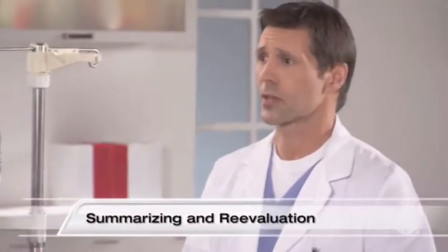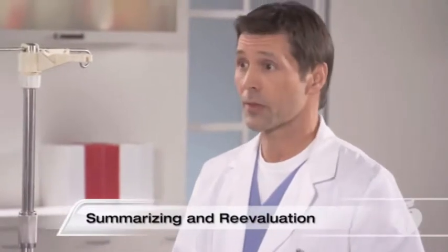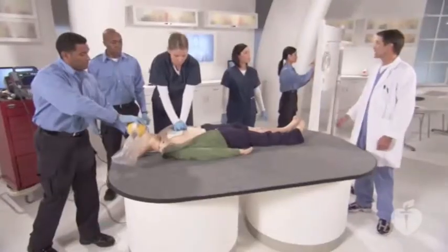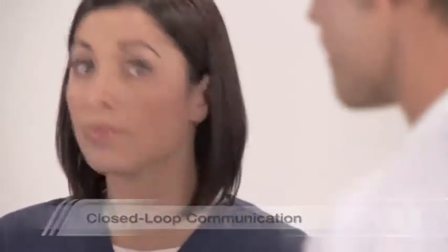We've given 3 shocks. After the second shock, we administered 1 milligram of epinephrine, and we've just given 300 milligrams of amiodarone. Our next drug will be vasopressin. Dana, please prepare 40 units of vasopressin. Drawing 40 units of vasopressin.